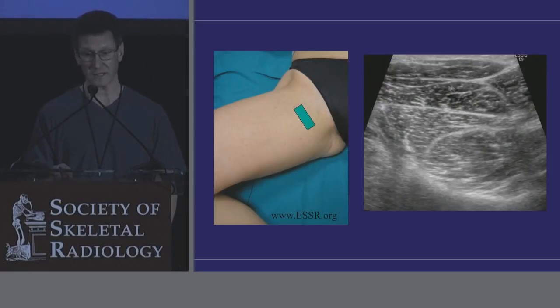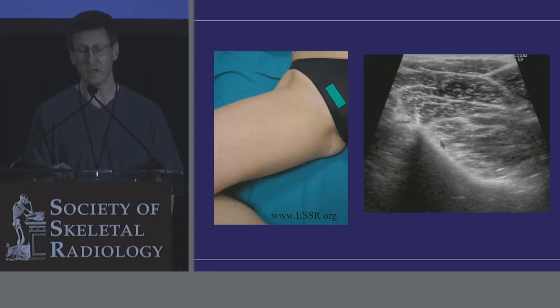If you go short axis, again, you see those muscles very nicely in transverse. And we occasionally get, in soccer players, or football players, they may have tears here. We'll be asked to evaluate for tear. We may be asked to inject or to aspirate a hematoma. And again, you just slide proximally a little bit and you'll come to the bone of the symphysis itself.